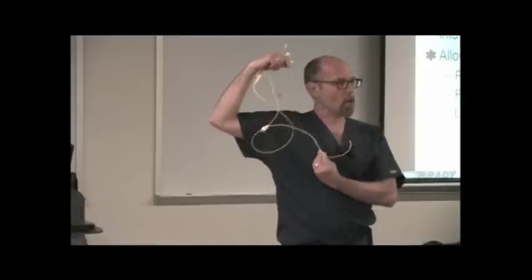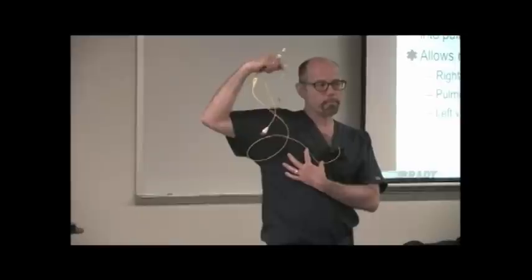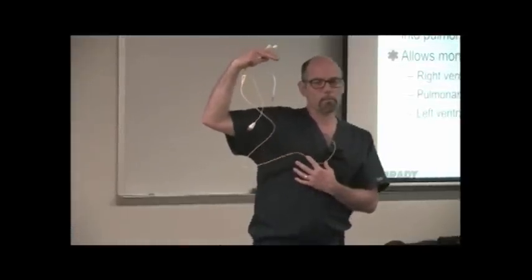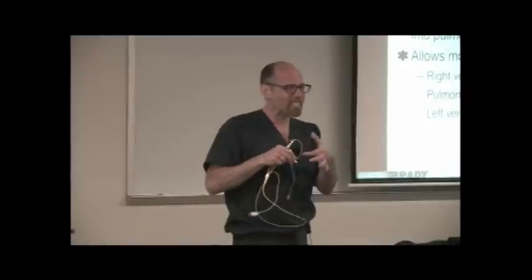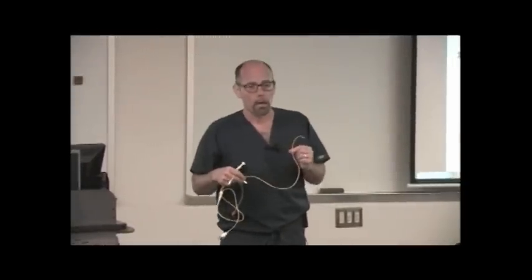We talked about some of the things already. This can cause an arrhythmia. It can cause a right bundle branch block because it's resting on the bundle branch, the bundle of His. It can develop clots on the end of it, so now the patient's got a blood clot sitting right in their pulmonary artery waiting to become a pulmonary embolism. It can puncture the right ventricle. It can puncture the pulmonary artery. Lots of bad problems with it.